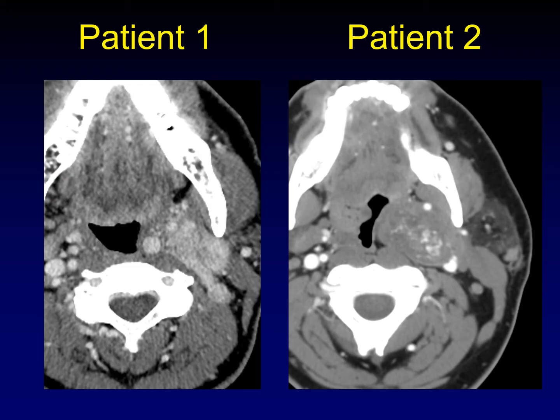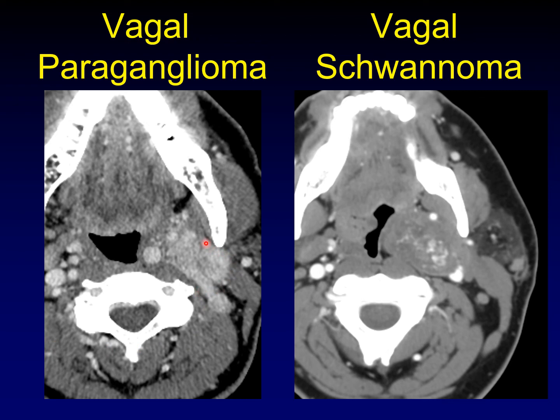What's different about them? The most obvious thing, I think, is their enhancement pattern. There is uniform enhancement throughout this mass — and how enhancing is it? It's almost essentially the same enhancement as the surrounding vessels; that's a lot of enhancement. Whereas in this mass it's pretty heterogeneous — areas of enhancement and areas of non-enhancement geographically interspersed because of Antony A and Antony B cells in a schwannoma. Whereas this extensive enhancement, when the enhancement matches the vessels, we start thinking about one of our most vascular lesions: the paraganglioma. So both lesions arose along the course of the vagus nerve between the jugular vein and carotid artery, but two different things arise from the vagus nerve — a paraganglioma and a schwannoma.